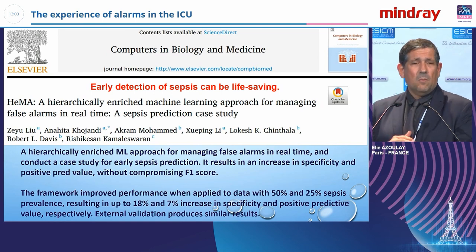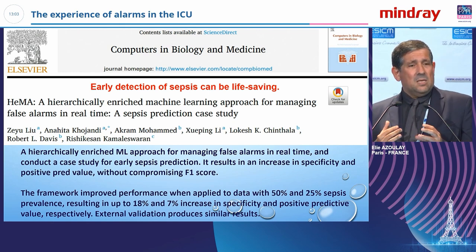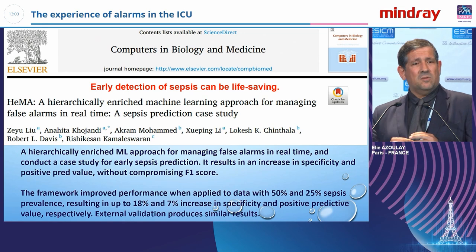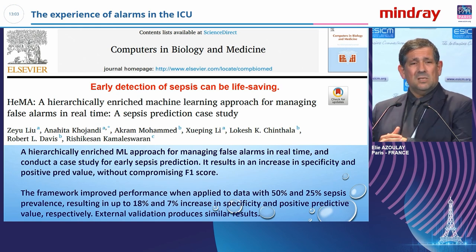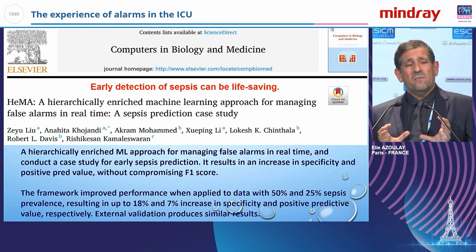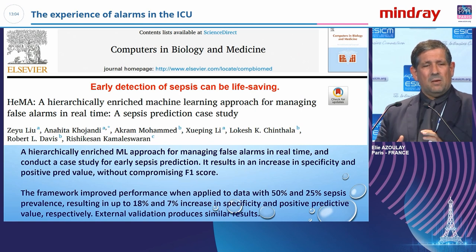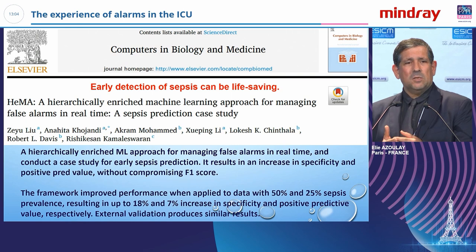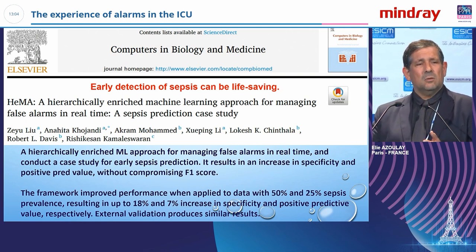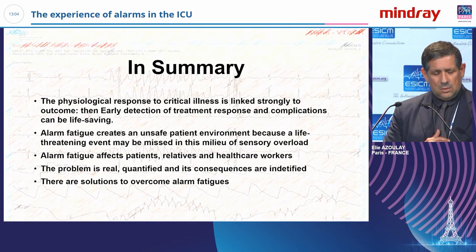One of the solutions would be to apply artificial intelligence to that. And there are many programs that are now active, some of them being pilots, some of them being already elaborated and validated, and some of them being used on a daily basis at some places. There is very little evidence that this translates into improvement at a patient, family, or healthcare provider level, because we are at the start of this, but we know that there are ways to really reduce alarm fatigue and reduce the toxicity of alarms, and we look forward to a literature that would then assess the impact of this on people's outcome in the ICU.